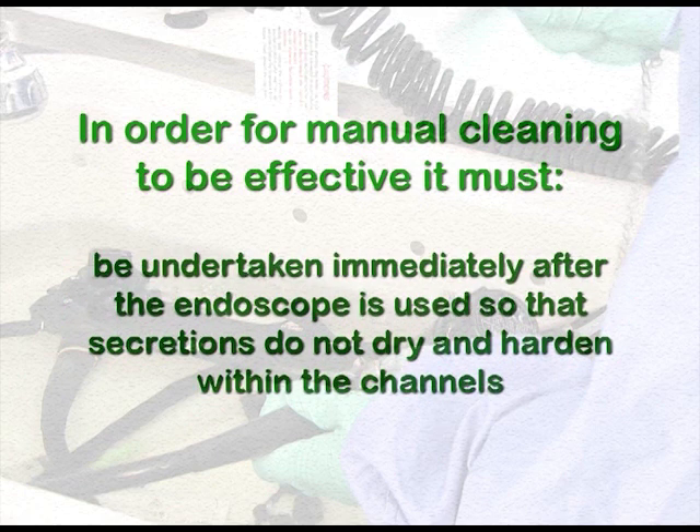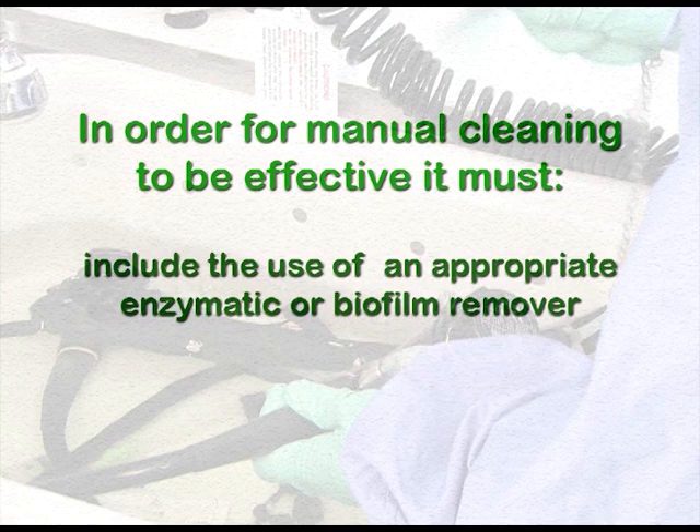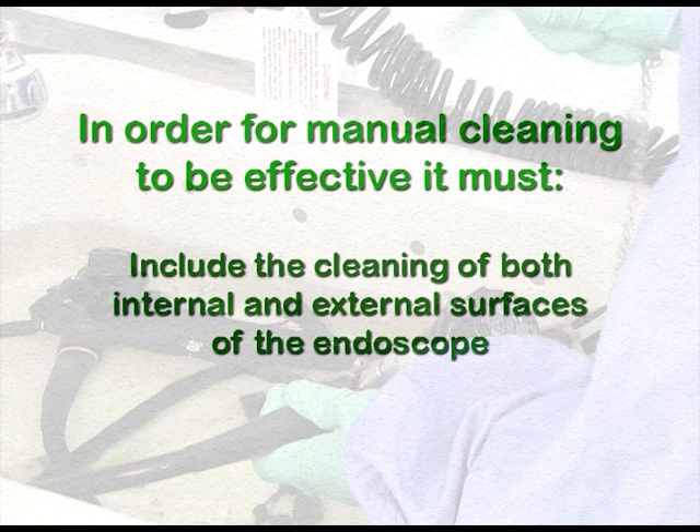Effective manual cleaning must be undertaken immediately after the endoscope is used so that secretions do not dry and harden within the channels. It must include the use of an appropriate enzymatic or biofilm remover, and include the cleaning of both internal and external surfaces of the endoscope.